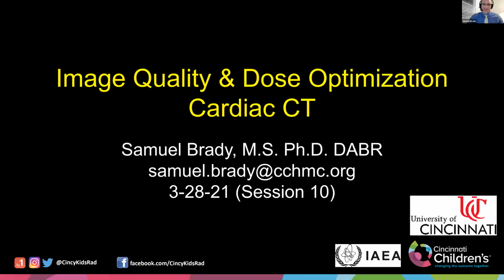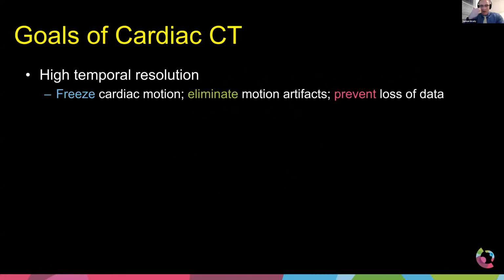Switching gears a little bit, we're going to talk about cardiac. Once again, for this talk, we're going to talk image quality and then dose optimization, all in one. It didn't make as much sense to do image quality and then dose at the end, so I'm basically going to talk about them both simultaneously throughout.